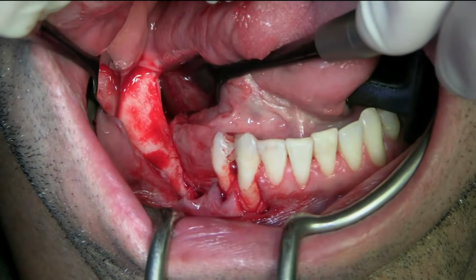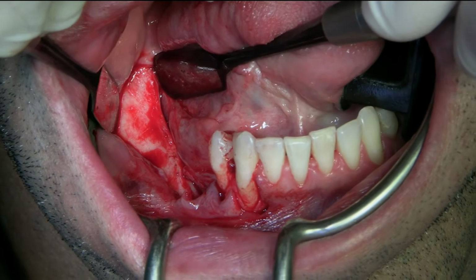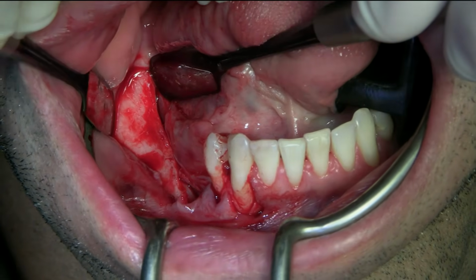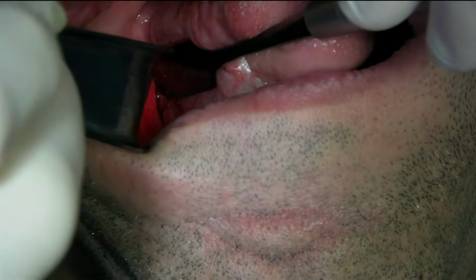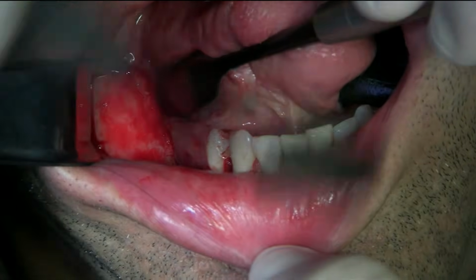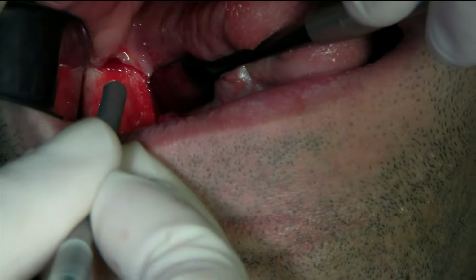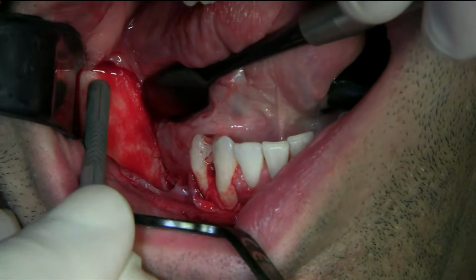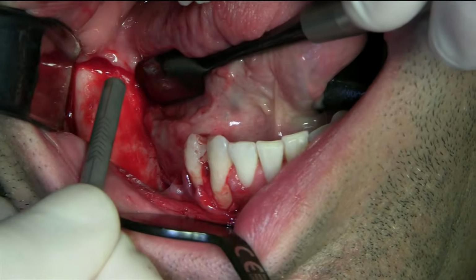But for the posterior area, probably need to change this to a Pritchett, not to a Minnesota, because I need to get in here like this. So here's my micros. So I'm going all the way to the distal.